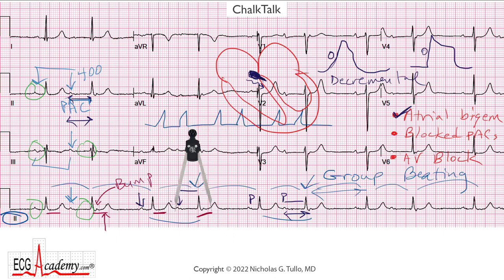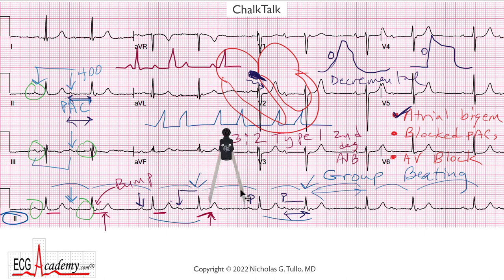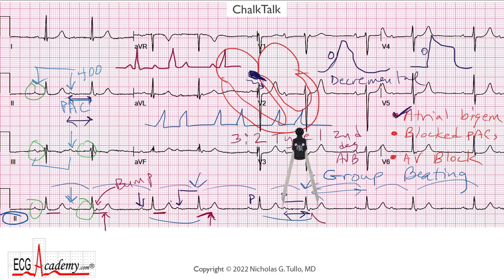Moving the calipers again, we're looking for three-to-two Wenckebach — that would be a very common cause of group beating, where you'd have a short PR, then a longer PR, and then the third P wave occurs on time but blocks, and then the PR gets shorter again. That's your typical 3:2 Wenckebach. But the P-to-P interval here is not regular — that's very unusual. So this is not just normal sinus rhythm marching through with 3:2 Wenckebach. The next P wave is timed when expected, the following P wave is regular, but the third P wave seems to come early. This bump at the end of the QRS complex has to be a P wave — it's absent in the others and is not part of the QRS — but the P-to-P interval is not regular.